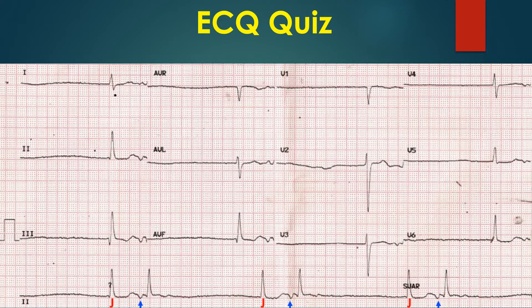But there is a caveat. This bigeminal rhythm appears to be an escape-capture bigeminy. But typically, the second beat in an escape-capture bigeminy is a sinus beat. It appears that here escape-capture bigeminy occurs in the setting of a low atrial rhythm, with overall features suggesting sick sinus syndrome. As the capture beat is not a sinus beat, another possibility is escape-echo bigeminy, a rare type of bigeminy.